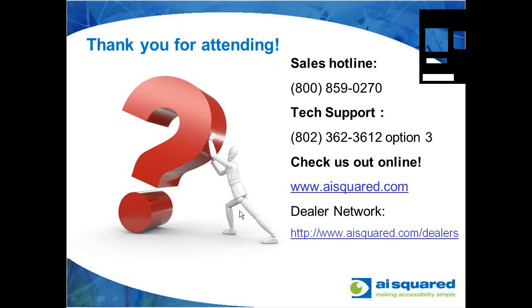Someone asked, I just saw a question that came in about distance viewing. Unfortunately, distance viewing is something that's not going to work very well with the ZoomText camera. It's the same situation as I mentioned at the beginning of the webinar, where you don't want to have the camera positioned more than 4 to 6 inches away from what you're looking at. If you've got something 10 feet away from you and you have to magnify it 30 times just to get it in view, it's going to be so pixelated that it'll be impossible to read.